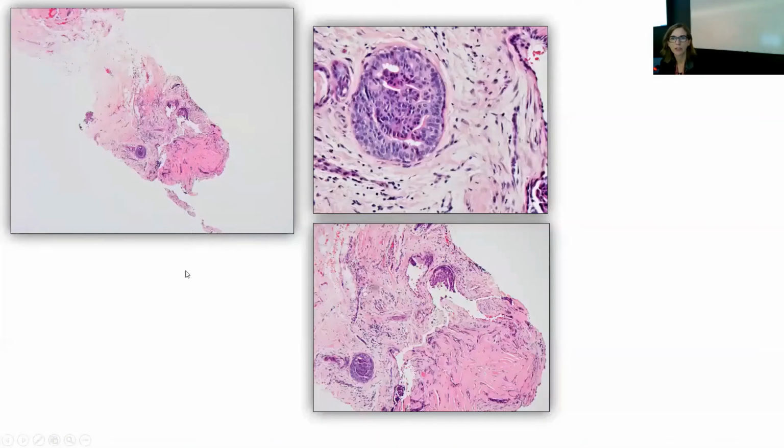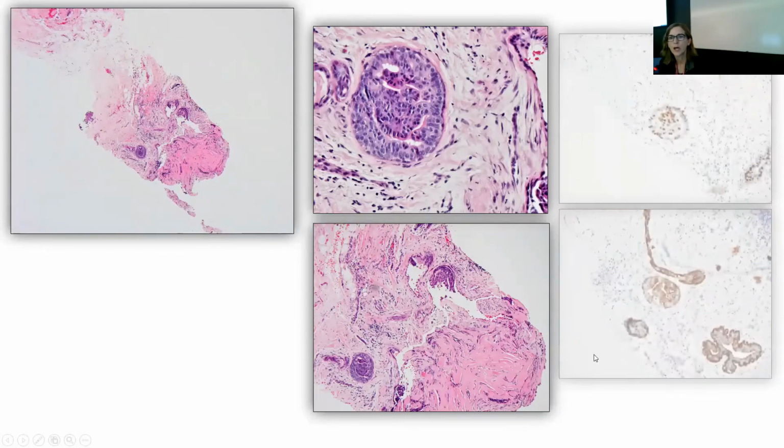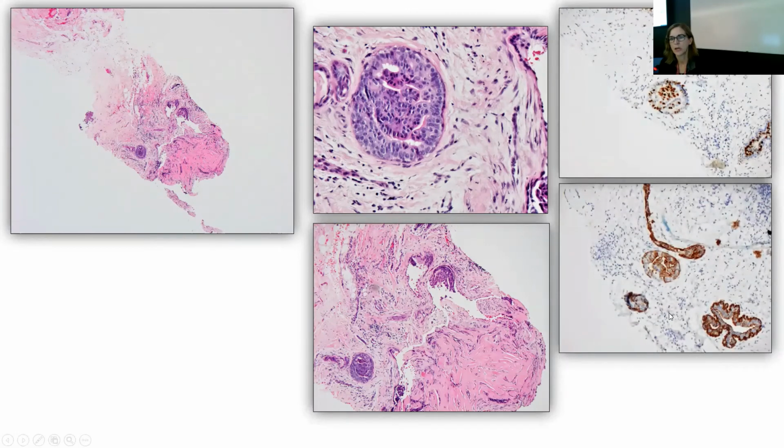So this is the case I received, actually my colleague received this week. Here is the core biopsy that had actually been diagnosed as atypical ductal hyperplasia, which is why the patient underwent excision. But you can see that there's this sort of dense sclerotic stroma. I actually think this looks more like usual ductal hyperplasia. There are slit-like spaces. It was really only this tiny area of epithelial proliferation, at least on the slide that we received for review. The primary institution did do ER and CK5/6, but didn't trust it or misinterpreted it and still called it, as I say, atypical ductal hyperplasia.